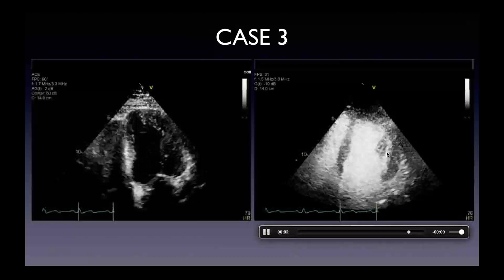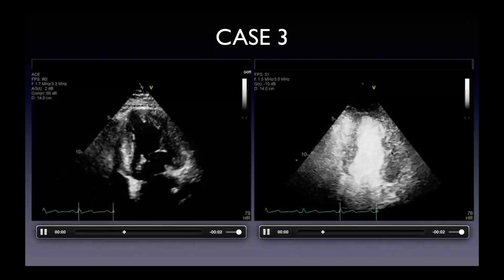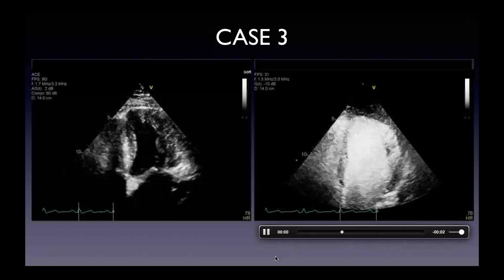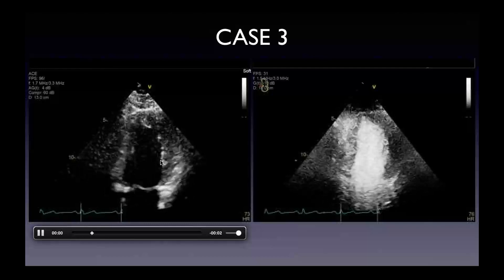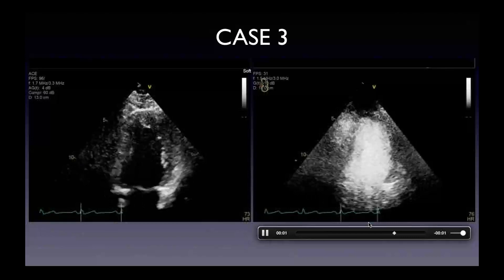Here's a different case — apical four-chamber view in case 3 — with more trabeculations in the lateral wall and that anterolateral papillary muscle. You can see the big anterolateral papillary muscle or trabeculations and then the true compacted myocardium. In the two-chamber view, probably a bit of foreshortening in the non-contrast, though also some foreshortening with the contrast images. With contrast you can see the trabeculations where the myocardium looks thick, and then it looks a lot better toward the true compacted myocardium.